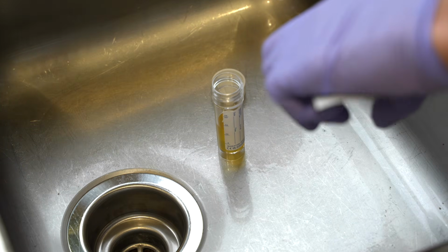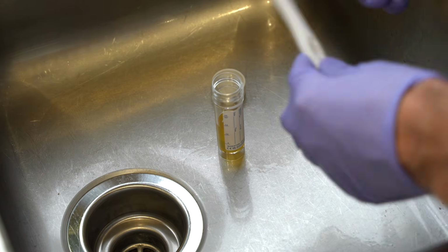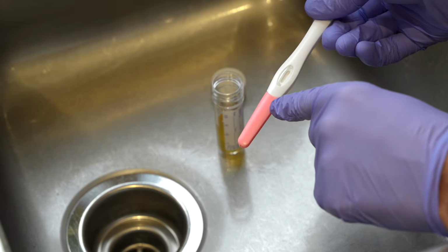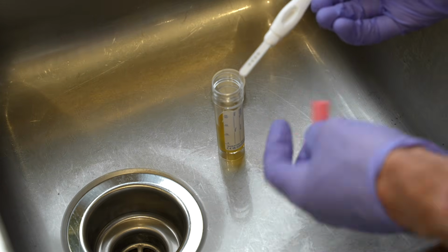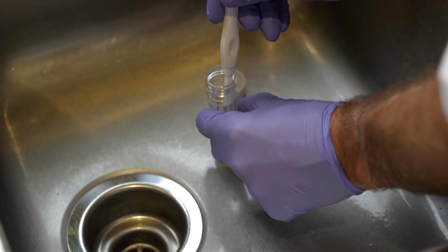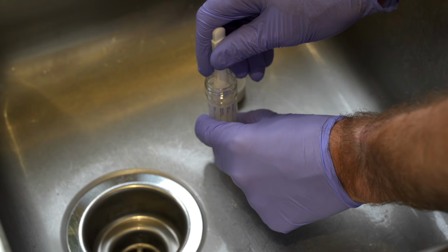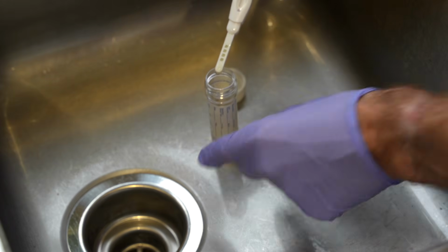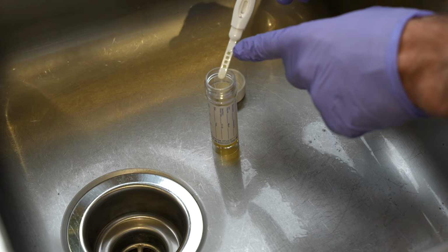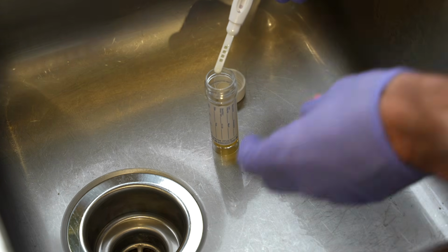So the pregnancy test is opened. And you can have some tests that the patient can urinate on, and others that you can dip. In this case, this one can be used in both ways. So we're dipping down into the urine, and we're giving 10 seconds. Then we're bringing it up. We can see all 4 squares have been hydrated, and the test strip is taking the fluid up.